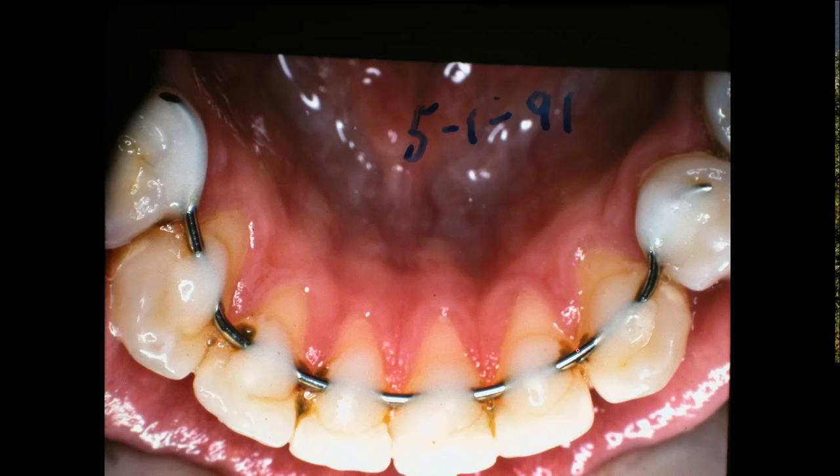But you can learn how to do that with what you can see in this video. And you know it'll work. And I use this on a lot of class 3 cases. Now he's not really going through here poking that little hard part of a floss through here, or a little brush, keeping that clean. It's got a lot of crud on that. And of course, I doubt if he's seen a dentist since he left.